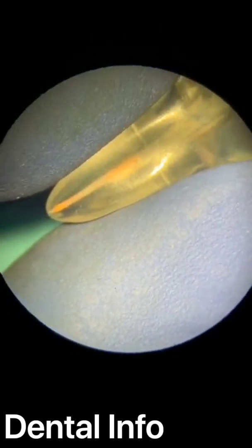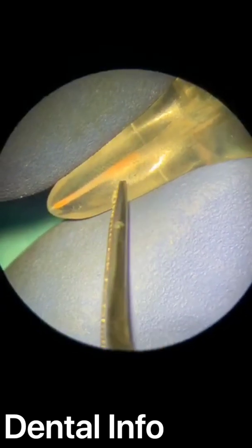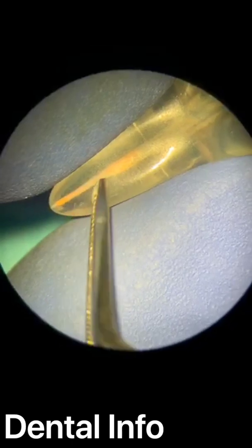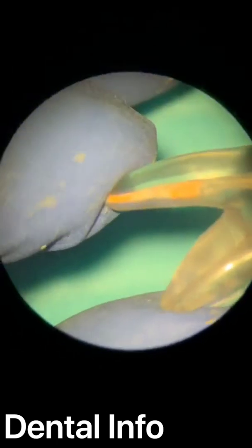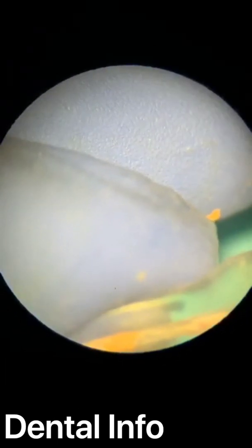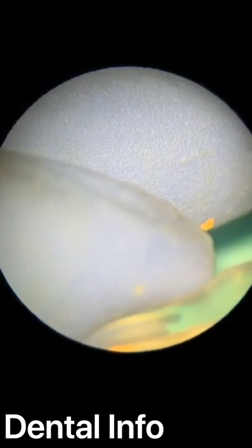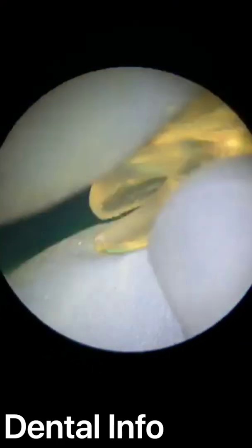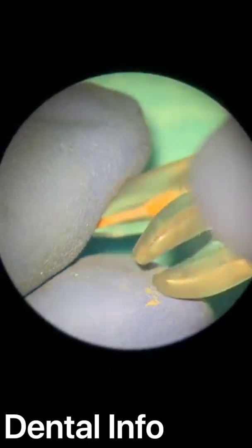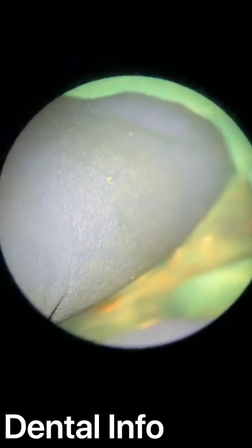Okay? Here I have about 5 millimeters filled. About 5 millimeters. That's not bad, it's good. Can you see here my sealer? Here, you see. Why we call it 3D obturation? Because it's filling the canal in 3D ways.